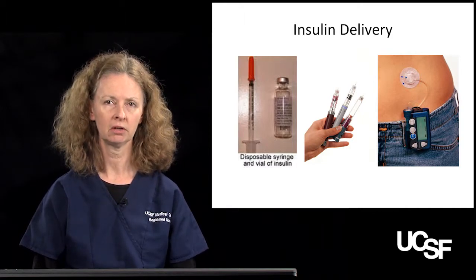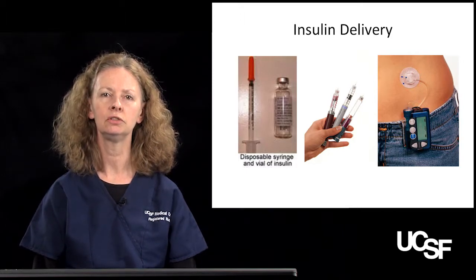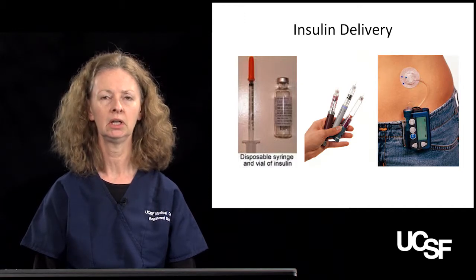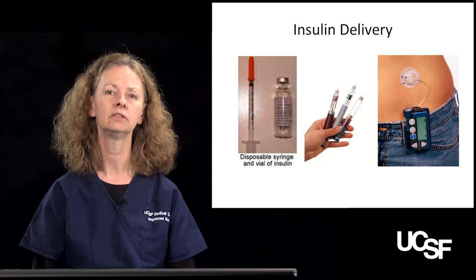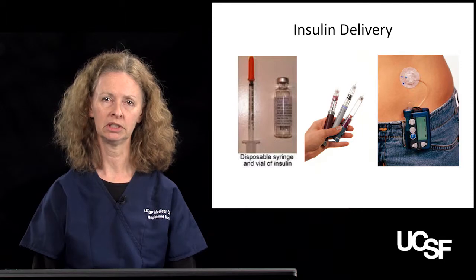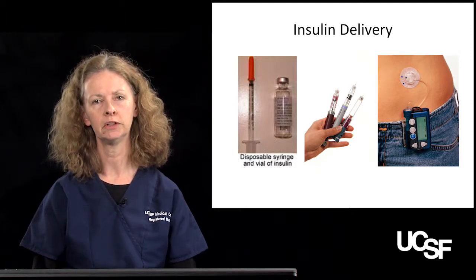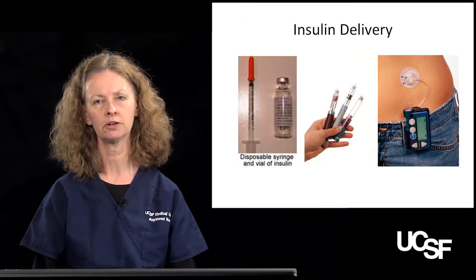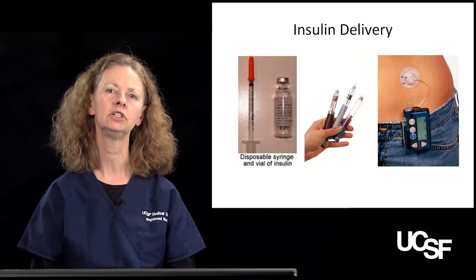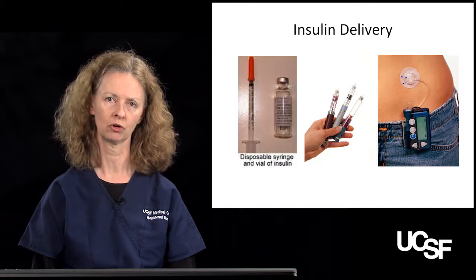Most of our patients are now using insulin pens. I think that some of the advantages to using the insulin pen is that they can be, when used properly, more accurate than using a vial and syringe. They also can provide some discretion when people eat out in restaurants. They also provide a more frequent turnover of the insulin. So in an insulin pen cartridge, there are 300 units versus 1,000 units that is in each of the insulin vials. So people tend to start new insulin more often.